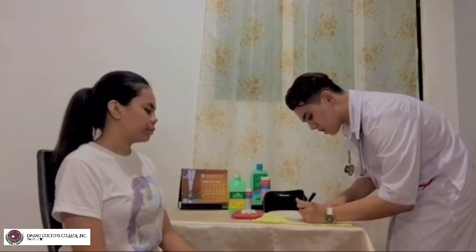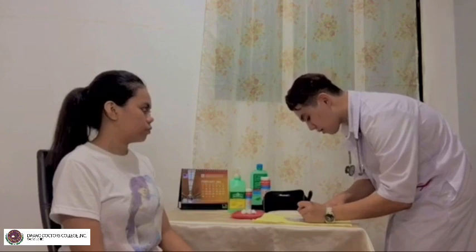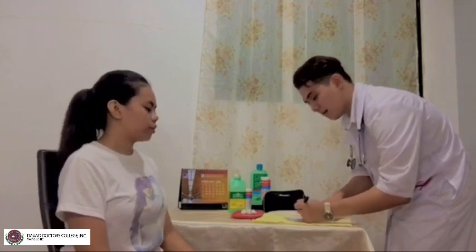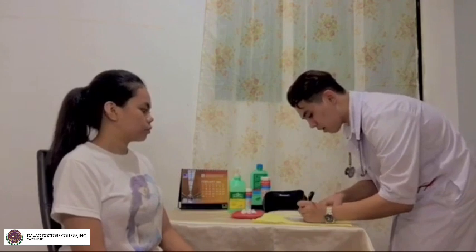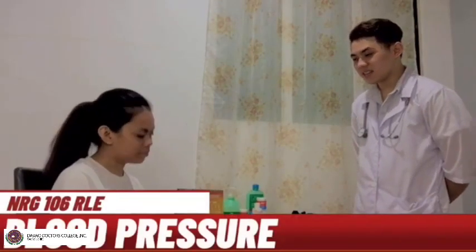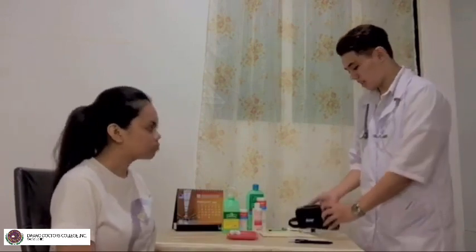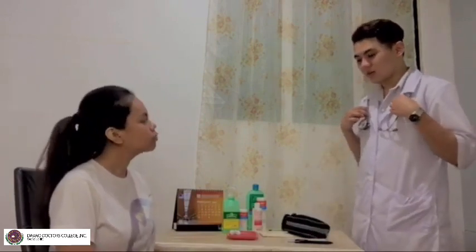So far, ma'am, your vital signs are normal, but to check, we need to check your blood pressure, okay? But you have nothing really to worry about because everything is normal. So, let us proceed with the blood pressure. Okay, ma'am, so today we're going to do the very last assessment, which is taking your blood pressure. I'm going to use this sphygmomanometer or BP apparatus and this stethoscope to assess if you really have a normal range of blood pressure, ma'am, okay?